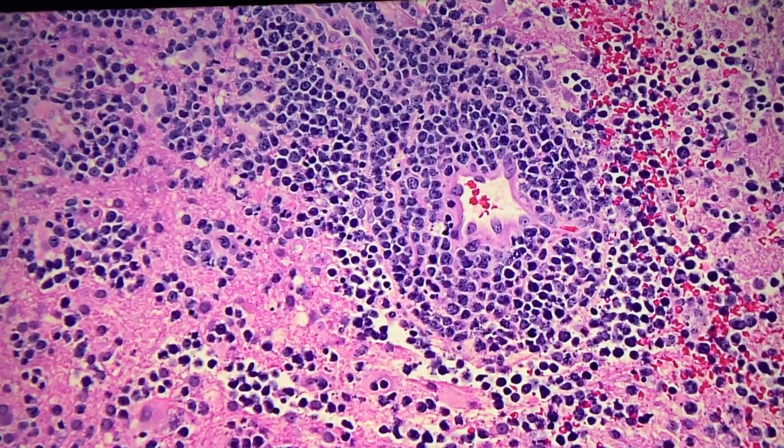So if this is something bad in the brain, what does it remind you of? What do you think it could be? Lymphoma cells. Lymphoma. This reaction around the vessels is actually really typical of a CNS lymphoma or high-grade lymphoma in the brain. You get this perivascular cuffing like this. So this is an example of lymphocytes in the brain, possibly some necrosis, but this is malignant.